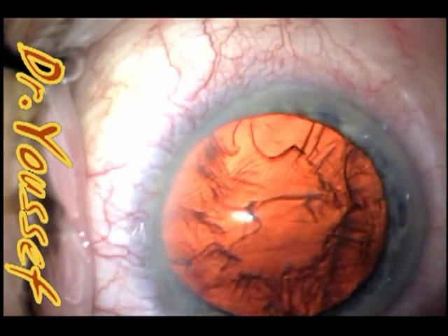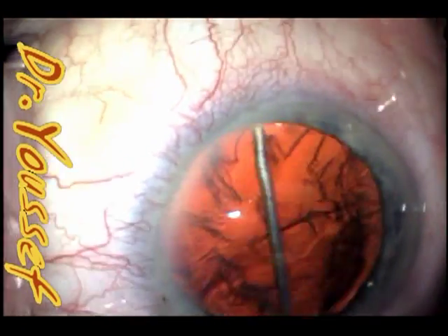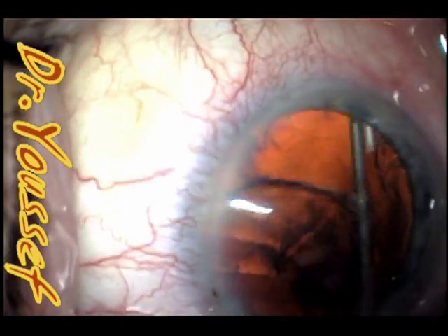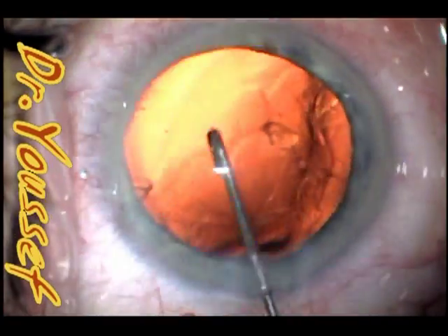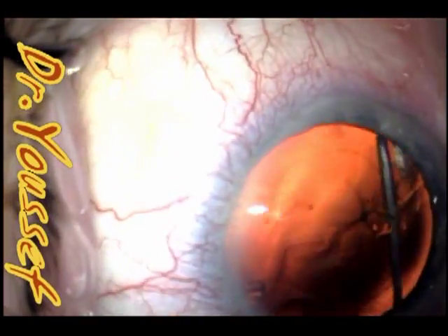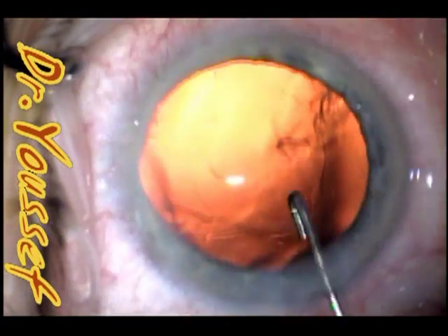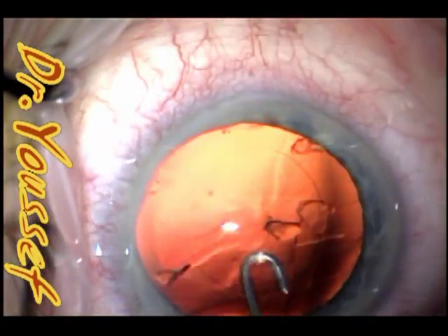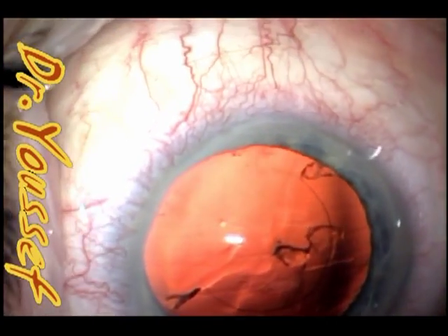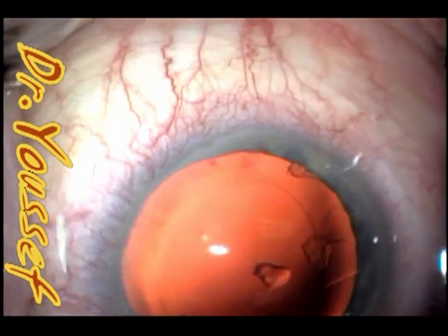What I created here is a defect in the cortical material to allow the J cannula to go in easily. When you have that defect, you can easily wash the cortical material by putting the J cannula at this area and irrigating — it makes life much easier and washes better.